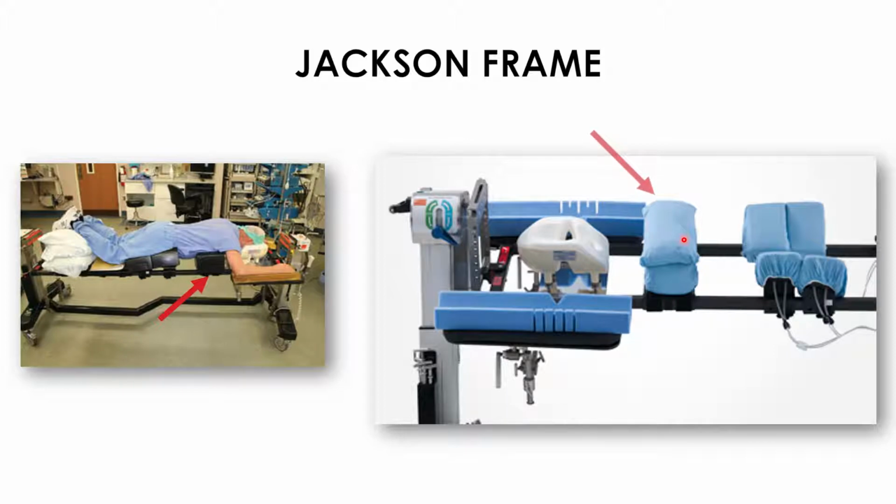We found, in the cases where we were losing upper extremity somatosensory evoked potentials, that this pad was moving, bunching up, and compressing in the armpit area. What we did is we put tape around the pad, not to compress it too much or it loses its padding effect, but enough so it doesn't slip when we're positioning the patient.